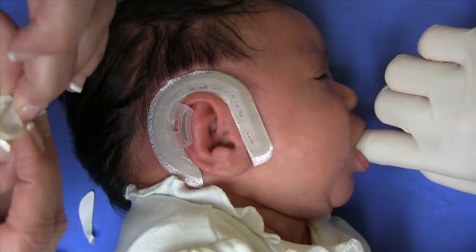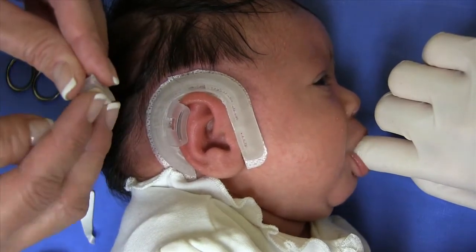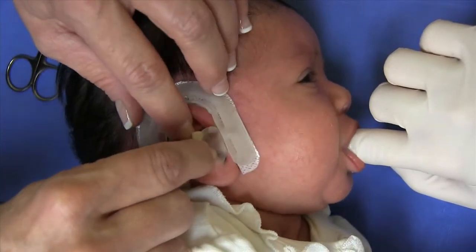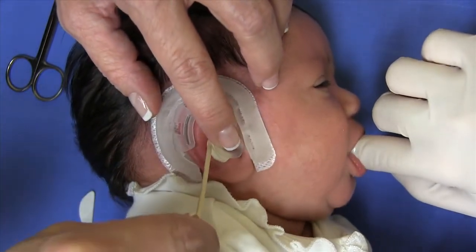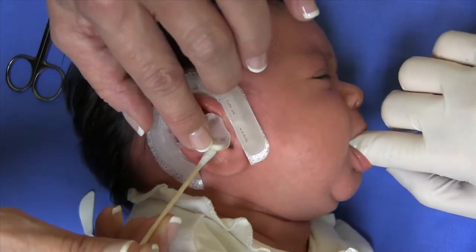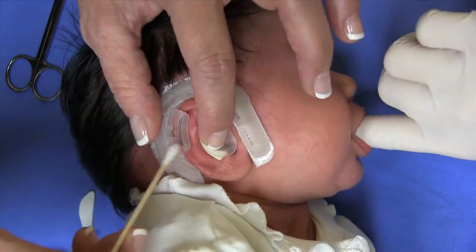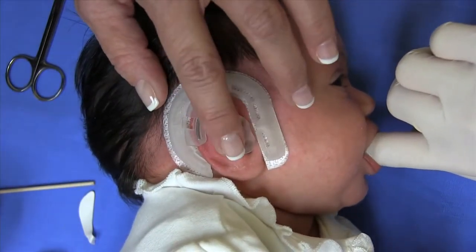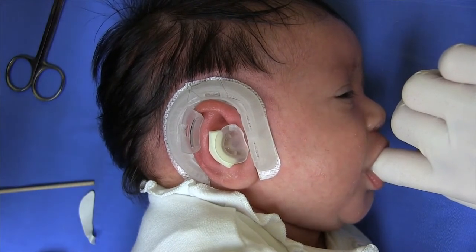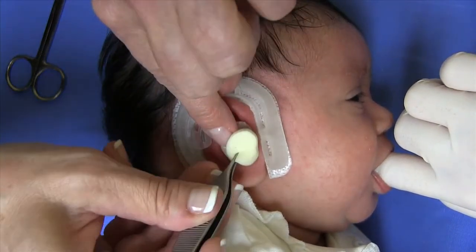Now what I've done with the conchal former is I've actually taken one of the foams and clipped it down so it fits around the back of the former, because I want to increase that pressure to open that up as much as we can. We're going to use a cotton swab to get that in there. In this way we're able to get all of that open, and we've created enough back pressure — and again that's foam so that's not going to be hard pressure — but everything fits nice and snug. I'm going to add a little bit of foam to the top as well, because it wants to roll forward due to that pressure. The goal is not to create too much pressure, just enough so we can get the last finishing touches on this.